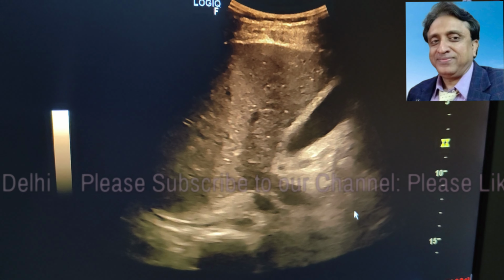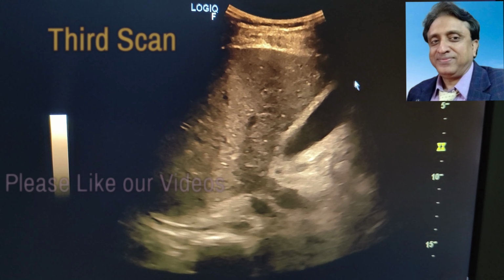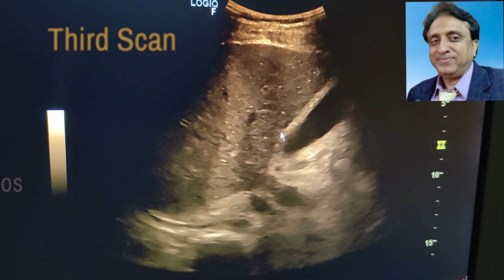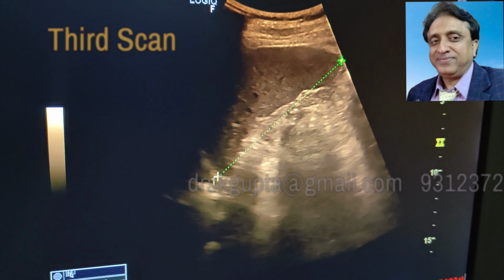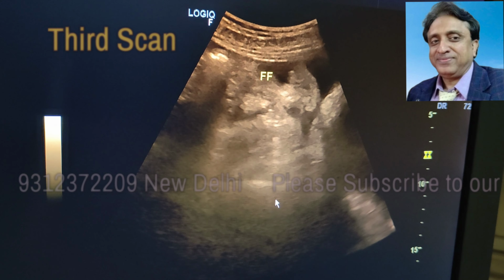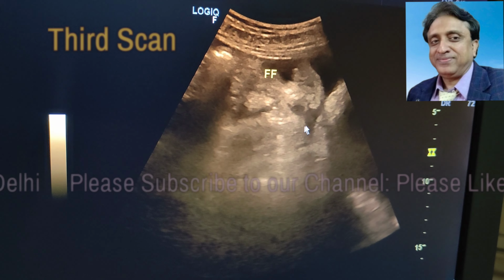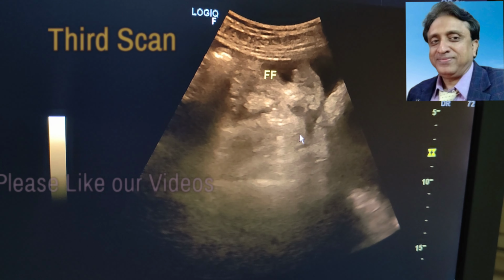This is the picture of the patient another few days later, and you find that the GB wall edema has further decreased, the pericholecystic edema has also decreased, and the spleen has further decreased. But there is some free fluid in the abdomen still present, and this is going to get absorbed with time. The patient has nearly recovered.